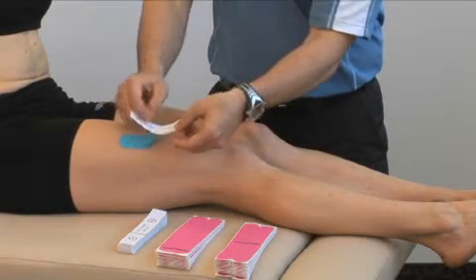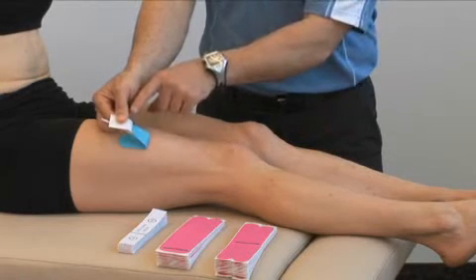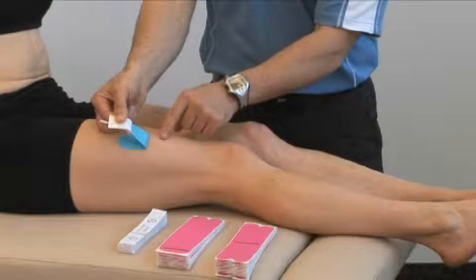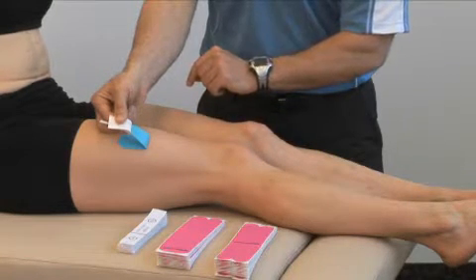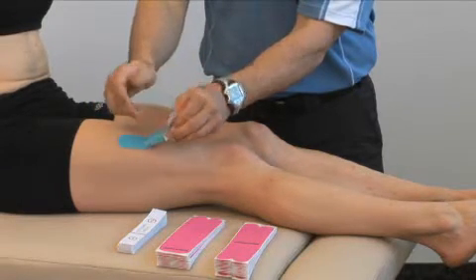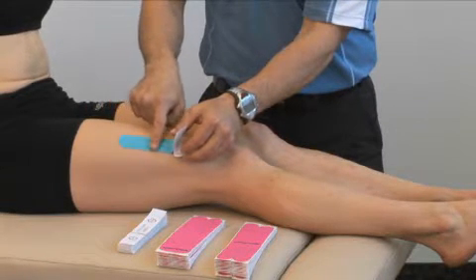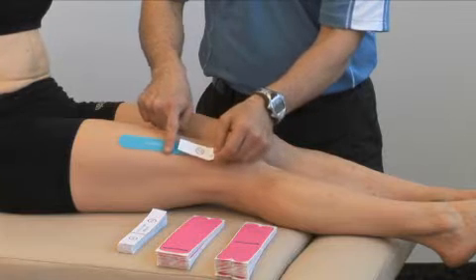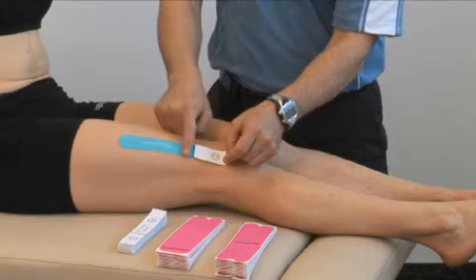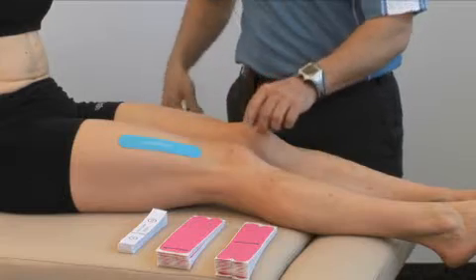When handling the tape, peel the backing slowly and hang on to the backing so that you do not touch the adhesive. Touching the adhesive will diminish the amount of time that the application will stay on the skin. So peel the backing, keep your contact on the backing, gently lay the tape down in contact with the skin, coming behind with your finger until about 90% of the tape is applied, and then remove the backing fully.